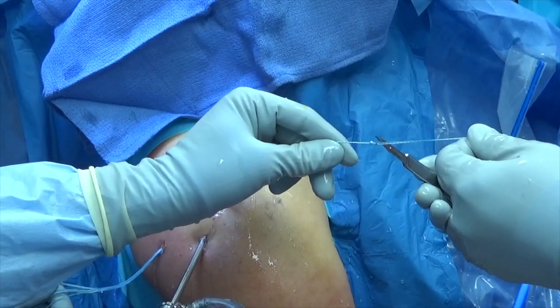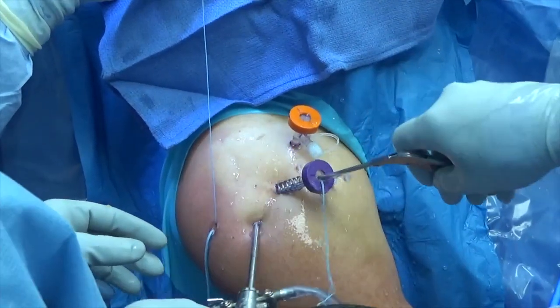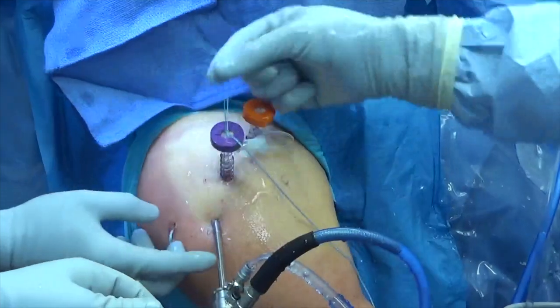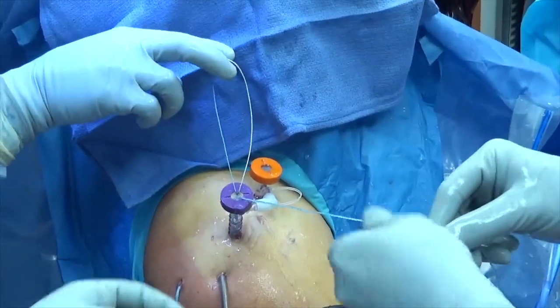The suture is cut and the corresponding sutures from the anterior and posterior anchor are then retrieved from the lateral portal. The free limbs of suture are separated, taking care not to entangle them with the previously tied suture.